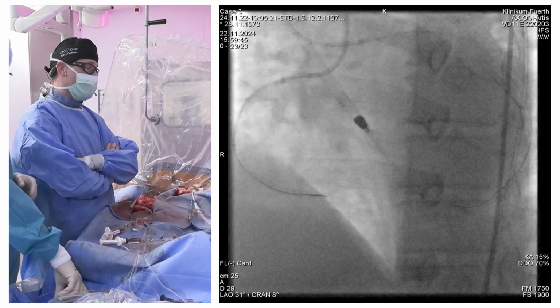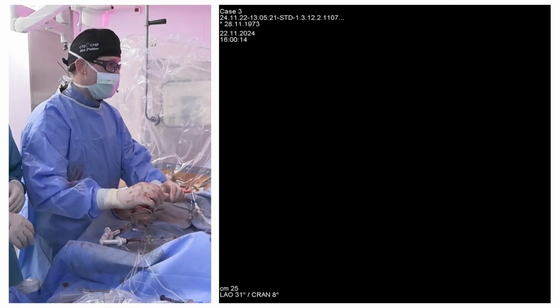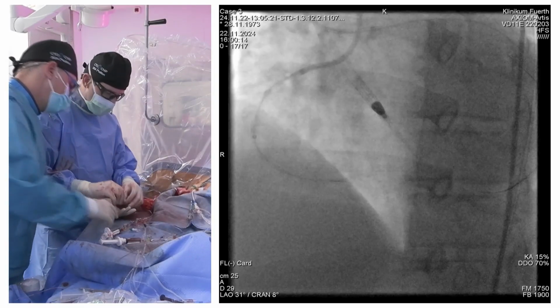So right now it's my Turnpike Spiral I've been using from the beginning, and I'm going to try a Gladius EX again.